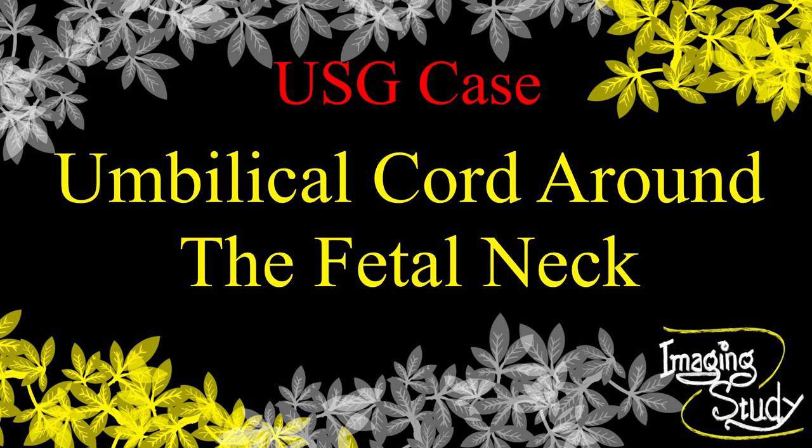Today we are going to see a common case of late pregnancy, that is umbilical cord around the fetal neck. One layer of cord usually doesn't disturb much for normal vaginal delivery, whereas two or more layers of cord around the fetal neck may seek medical emergency and create an indication for cesarean section.